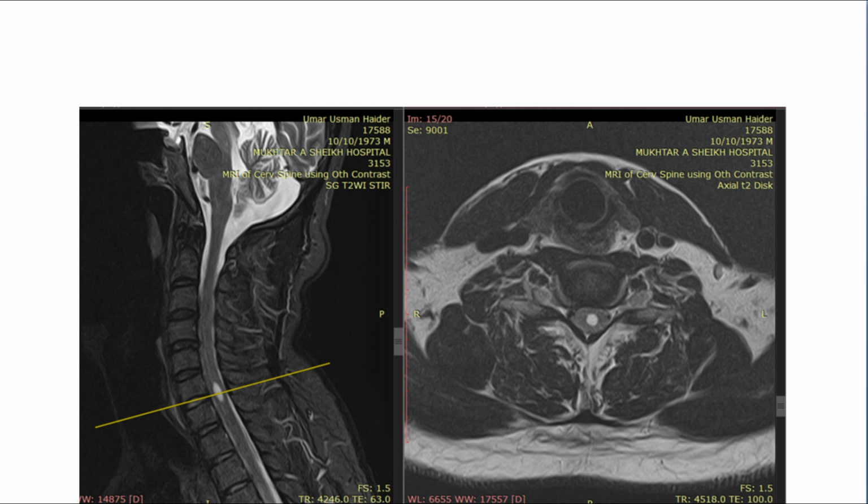Okay, what happened over here? Anyone, quick one-liner, what's this? Sorry? Syrinx, yes, it was. And he was running around to different people because somebody told him it's a demyelination. He had it for almost a year, even a repeat scan.